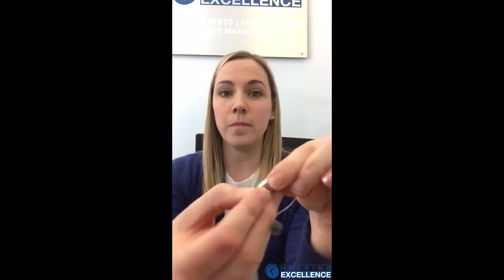So make sure you have a good battery. You'll open it up and change it. Even though you might have put in a new battery, sometimes you can get a bad battery. So what you're going to want to do is change that battery and make sure you have a new one.